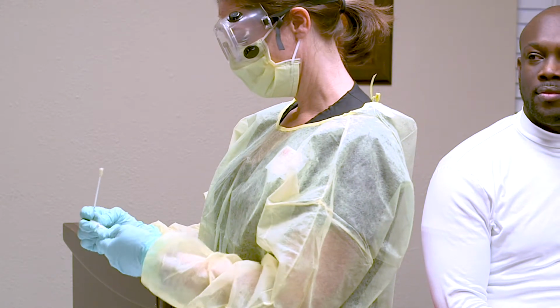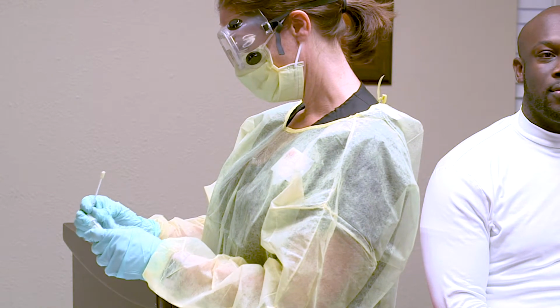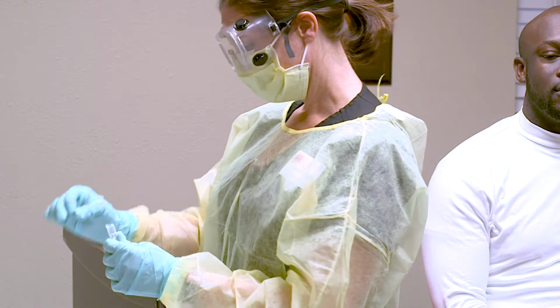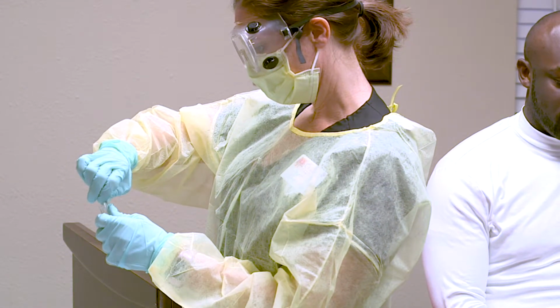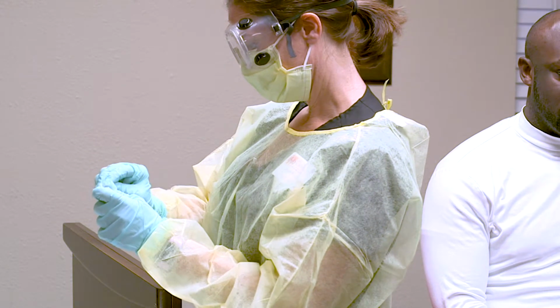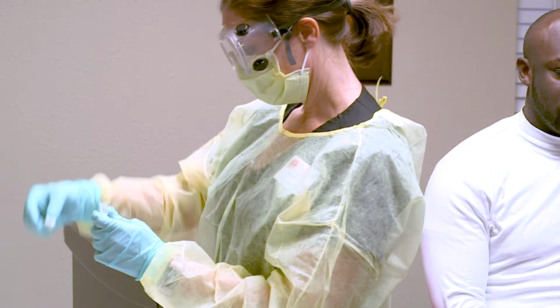Break the swab off into the tube as follows. With the other hand, grasp the swab shaft at the very end with the thumb and first finger. Lean the part of the shaft with the breaking point against the rim of the tube. Bend the swab shaft at a 180-degree angle to break it off at the colored ink breakpoint mark.